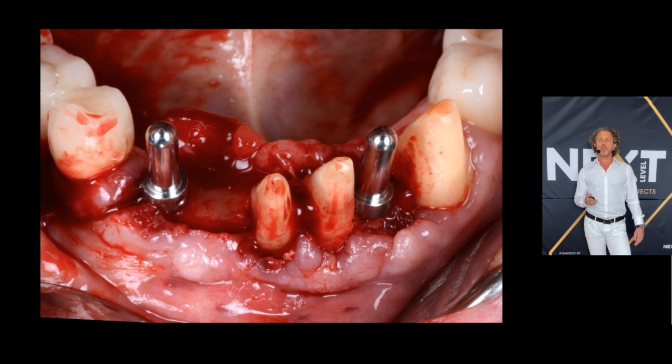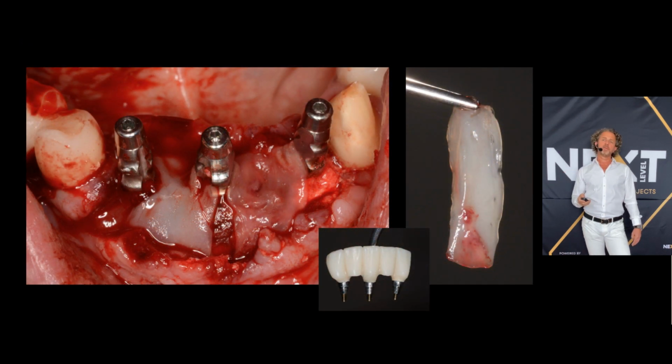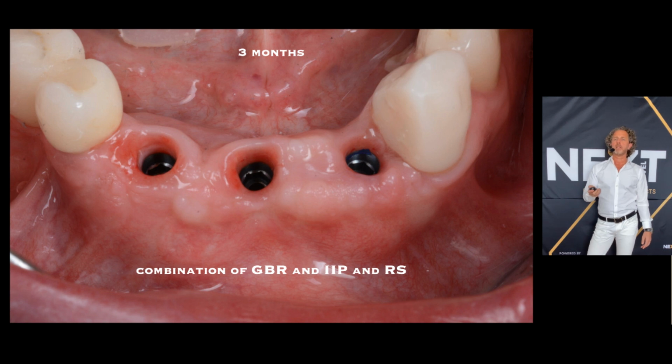I checked the implant position on both sides, placed the implants, extracted the hopeless tooth. Now you can see how large defect we have on the buccal side of the implant. But I placed it far more lingual, made a GBR, and, which is the magic, I left the other root, I cut back to bone level, covered it with PRF, I took an immediate impression for the temporary, which is on the right side. I closed the site, and this is what we got after 3 months wearing that immediate temporary on these 3 implants. So this case is a combination of GBR, immediate implant placement with the temporary, and the root submerge.